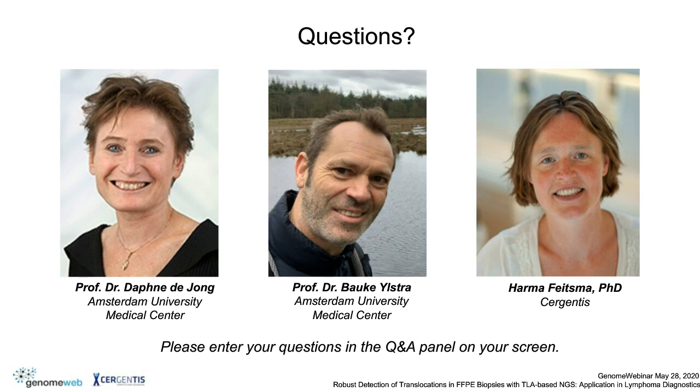Great. The next question is for Daphne. How important is and will be detection of single nucleotide variants and copy number variants in lymphoma? Well, that's a very interesting question, and we have a short-term and a longer-term answer to that. The short-term answer is that in practice we already use single gene mutations in lymphoma diagnostics, as pointed out, for the diagnosis of lymphoplasmacytic lymphoma. Demonstration of MYD88 mutation is very important, as is CXCR4 mutation, as that impacts even on response to treatment.